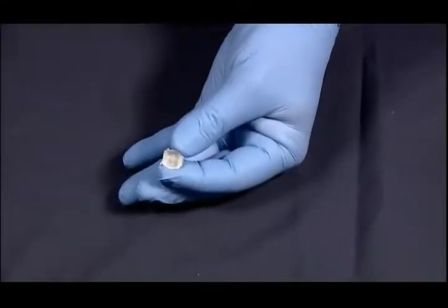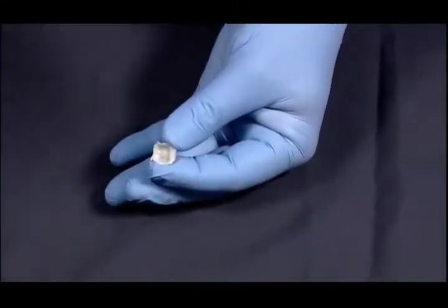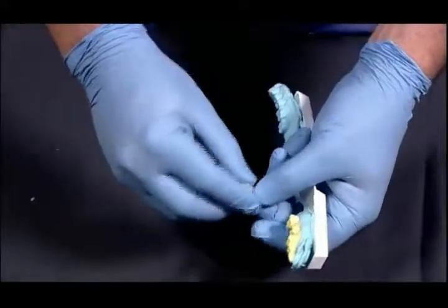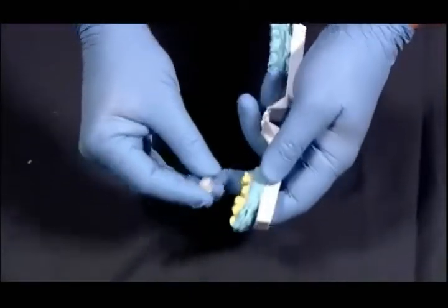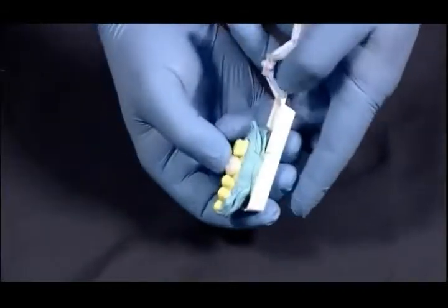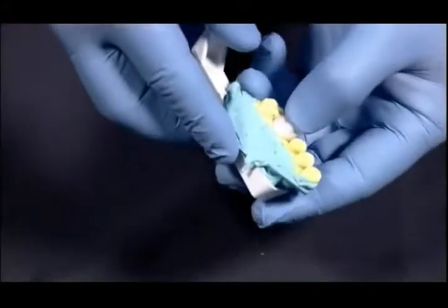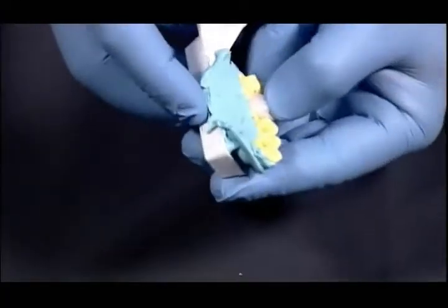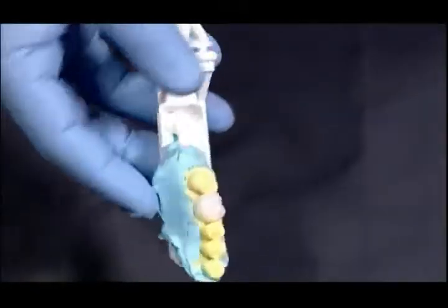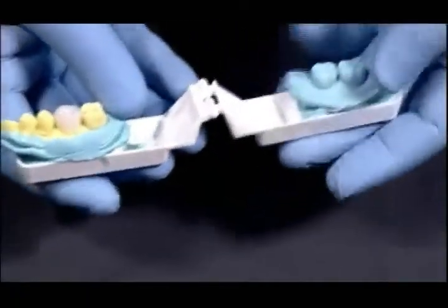From here, your assistant will take it to the lab, just like they've been doing for years making provisionals. They'll go back and trim this and polish it. The finishing and polishing process has been done on this particular crown form, and what we're going to do is try it back on the die, and you'll see the marginal integrity. You have to realize we're utilizing a material that we probably don't have the exact match of color like you'll be able to get in the tooth, but you can see the translucency that's built into that crown, and it really gives you a very natural look to the crown.